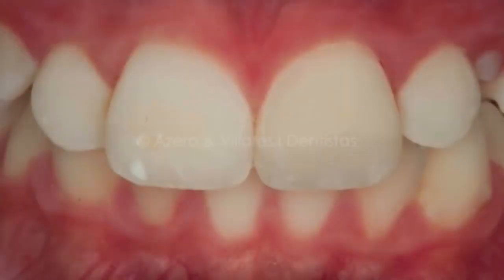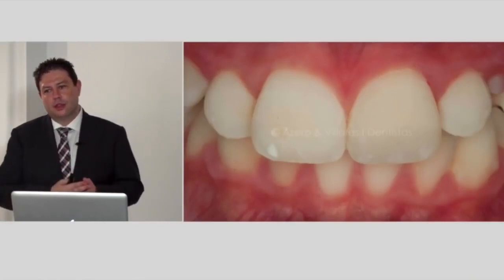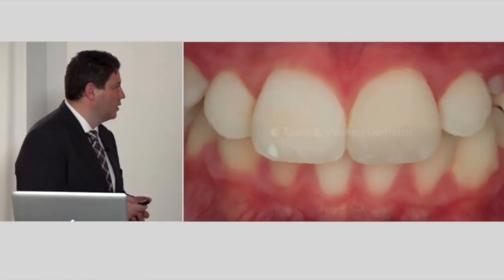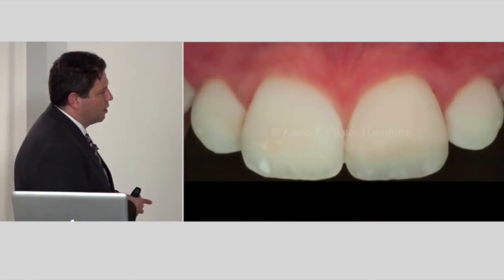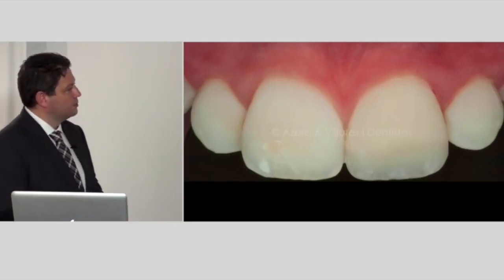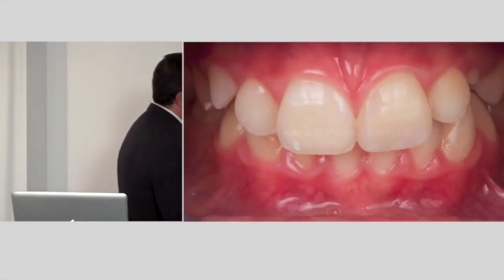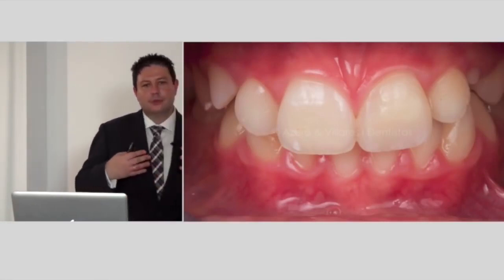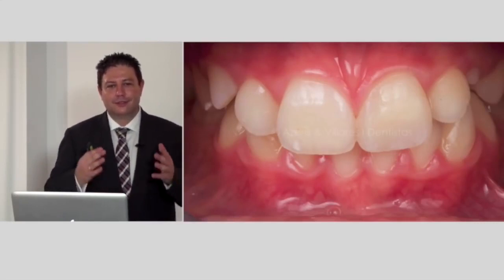And then what we do is check our restoration with the polarized system, static photograph and dynamic polarized system with the smile light, and this is with the polarized. And always review the case, as I said at the beginning, to check what you're doing and review the whole.